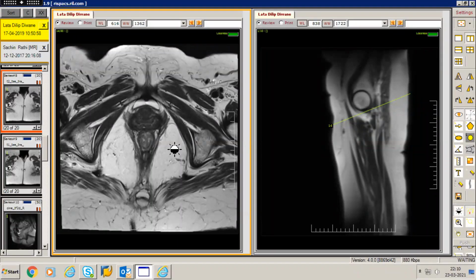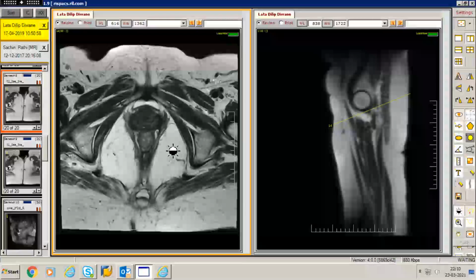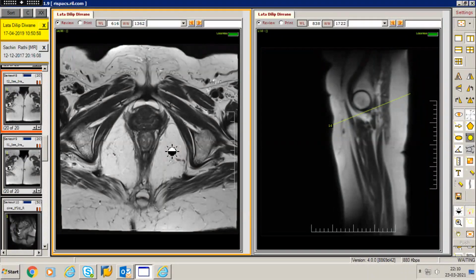That's why I wanted to show you this: you don't need major levator plate, levator shelf, puborectalis dysfunction, and hiatus widening. You could have just minor endopelvic fascial injuries, type 1, type 2, or type 3 defects, and they can actually lead to the patient having prolapse-like symptoms. So it's very important to remember the anatomical configuration of these structures on the actual images. Don't just concentrate on the sagittal plane, which is the so-called money sequence when it comes to defecogram.